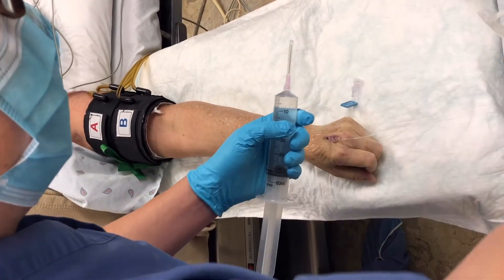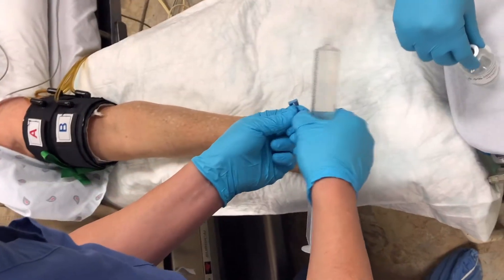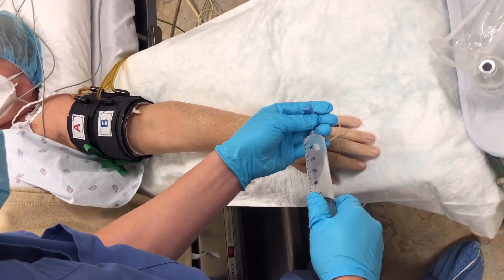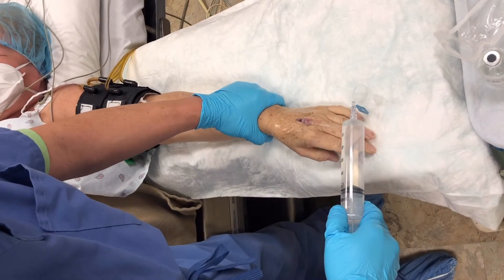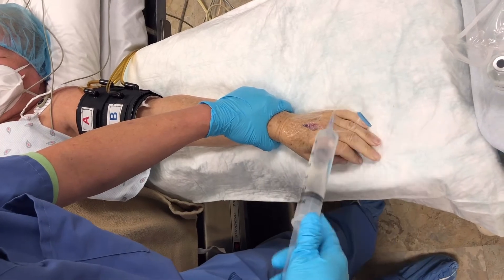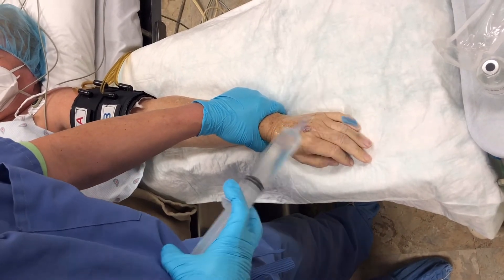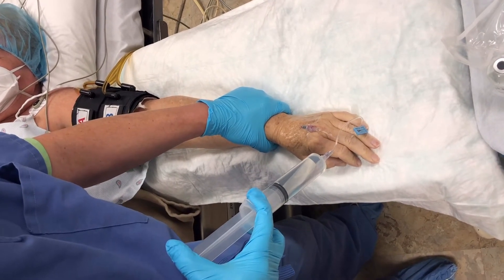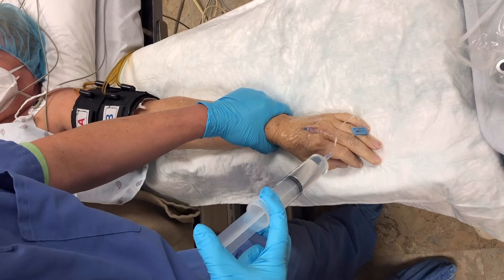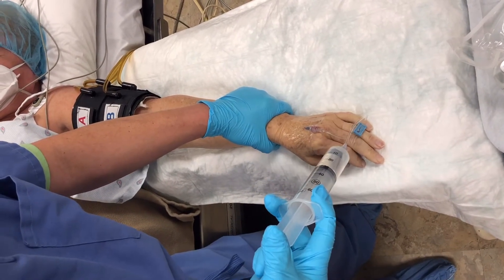Now I'm going to inject the half percent lidocaine. When I inject, I generally squeeze the wrist to try to make the lidocaine stay distal. Generally, if you put the tourniquet on the upper arm, you inject 50 cc of half percent lidocaine.